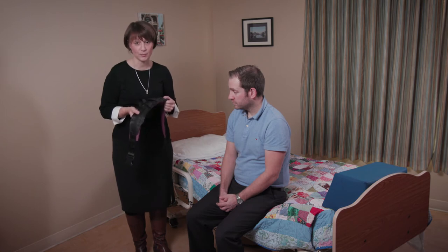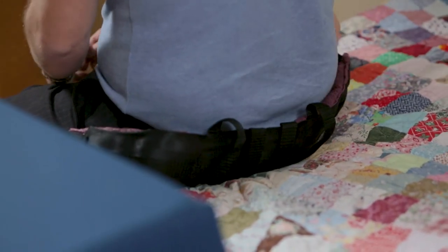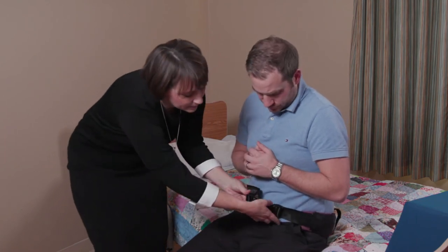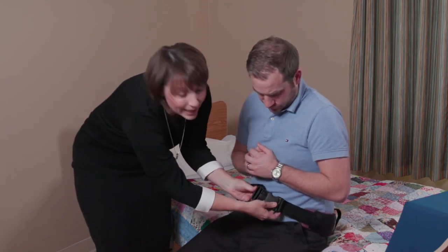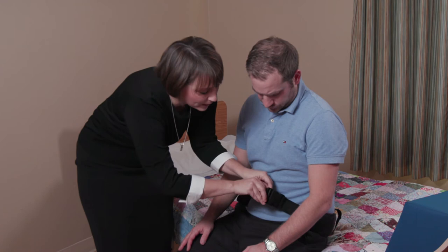That's where the transfer belt comes into play. It's not to lift the client but it is to help guide them and support them. To put this on, we've already adjusted our bed height to make sure that it's raised high enough so that we're minimizing our bending and reaching, and also allowing Chris to stand up a little bit more easily. We're just going to slip the belt behind him and come through — if he can put his arms up for us — and then we're going to cinch this belt. You can see here, this is an extra large belt, with the benefit that you can cinch it to fit any waist.